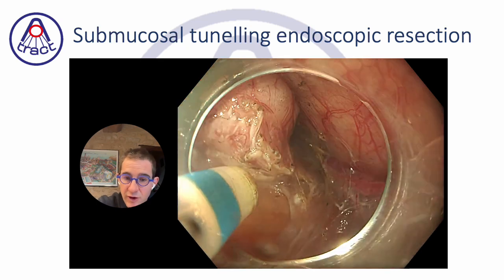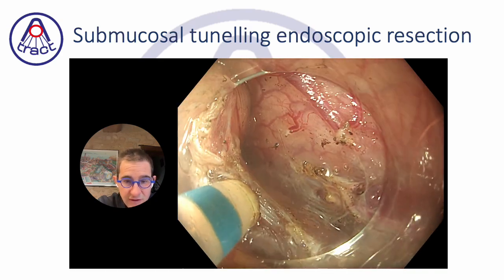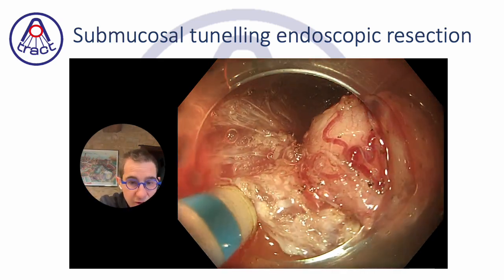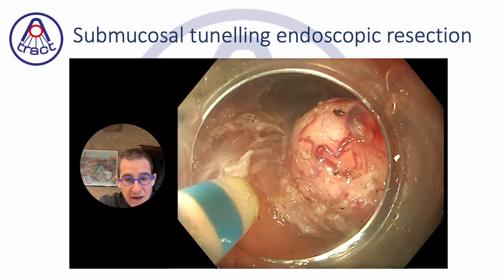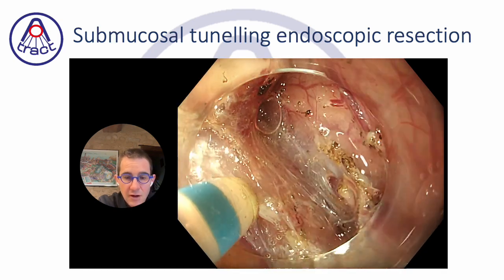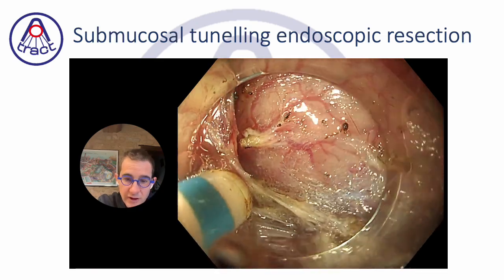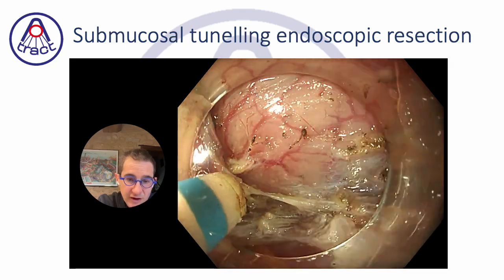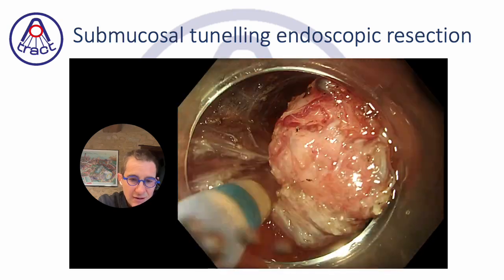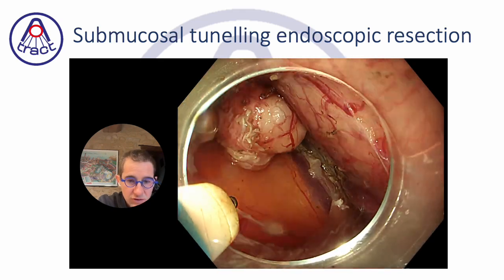The anesthesiologists were focused on the pressure and the capnia, and finally nothing moved. So despite the fact that the perforation seems complete, probably the free space around the stomach was not totally reached, without any gas collection, without any pneumoperitoneum, and therefore without any impact on the ventilation by our anesthesiologist. So I think we should be relatively cautious because a lot of vessels are in this area, relatively big compared to what we are dealing with usually in the submucosa. So it's probably important to go slow and to avoid any damage on the muscle.